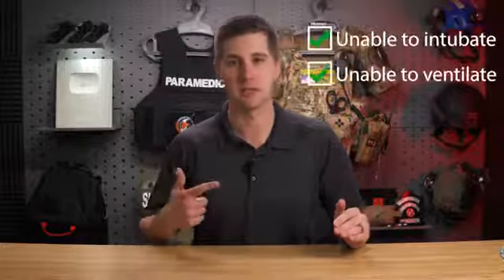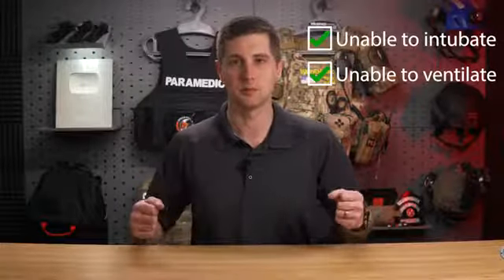So the indications in civilian EMS are when you are unable to intubate or ventilate the patient. Intubation is the act of putting a laryngoscope into somebody's mouth and directly visualizing the vocal cords and dropping an endotracheal tube into that person to secure that airway. We want to secure airways because that will inflate a balloon. It will not allow any gastric contents to come out of the stomach into the airway.